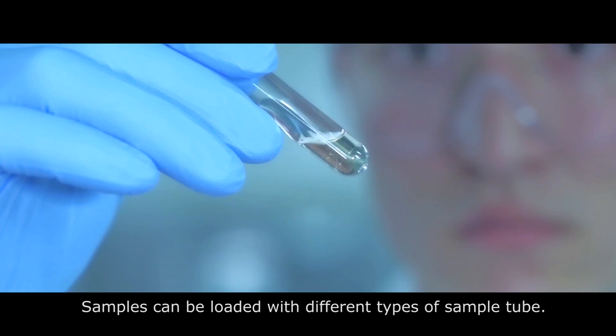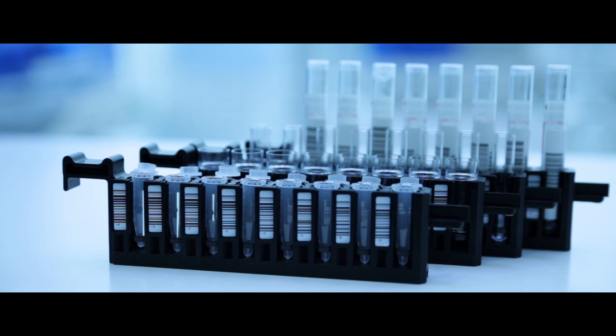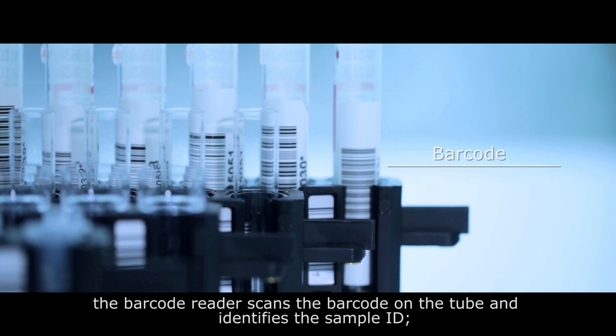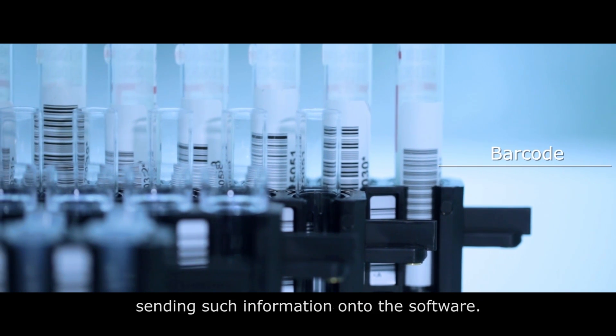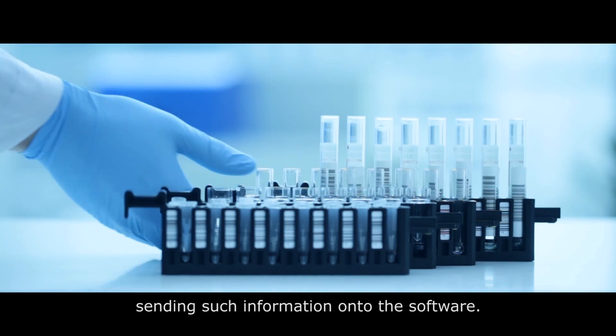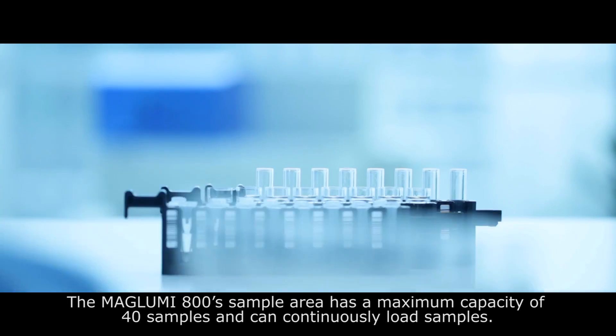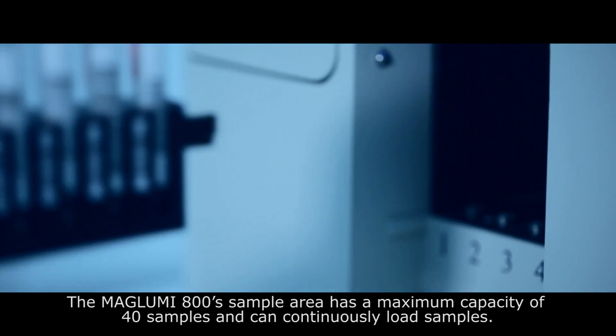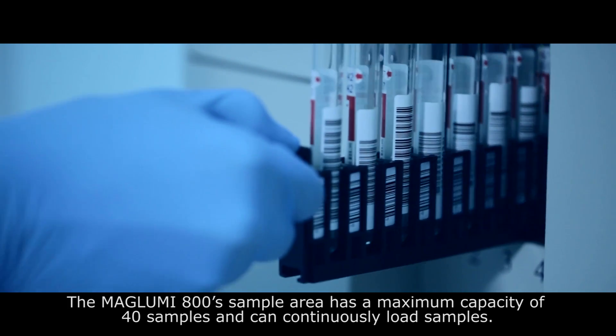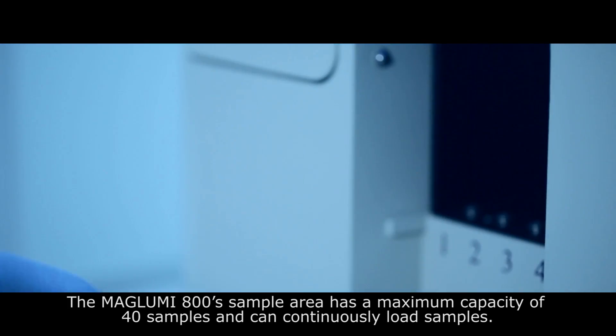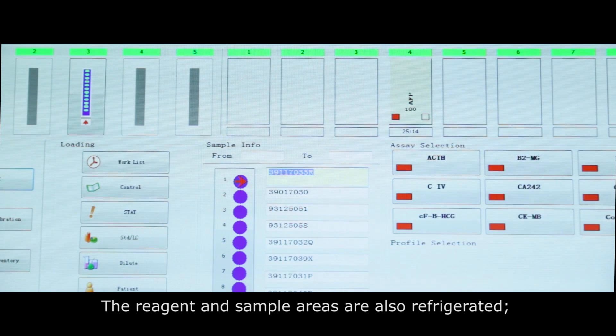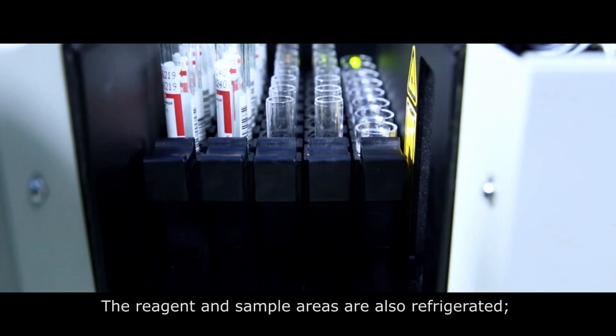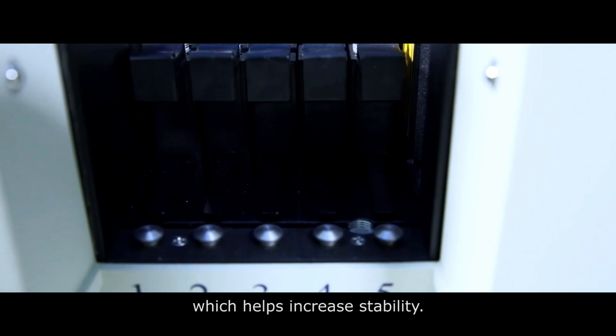Samples can be loaded with different types of sample tubes. When loading the sample, the barcode reader scans the barcode on the tube and identifies the sample ID, sending such information to the software. The Maglumi 800 sample area has a maximum capacity of 40 samples and can continuously load samples. The reagent and sample areas are also refrigerated which helps increase stability.